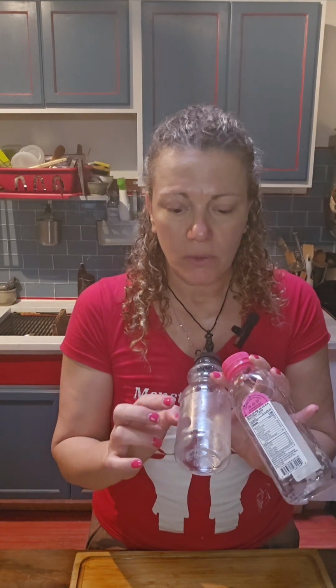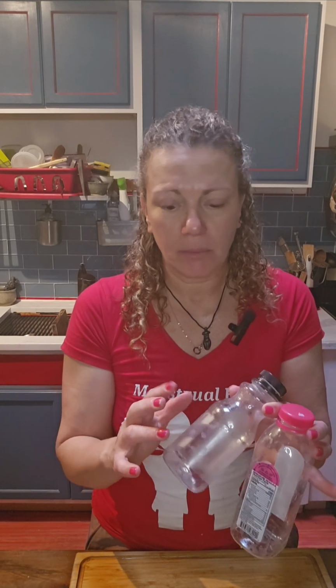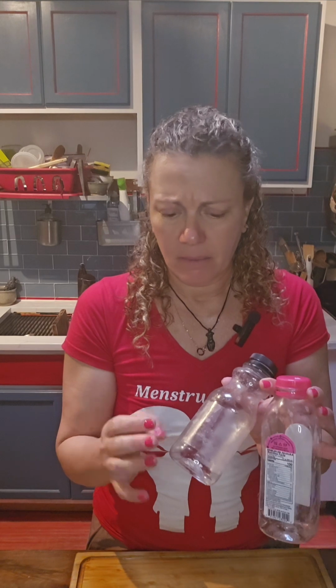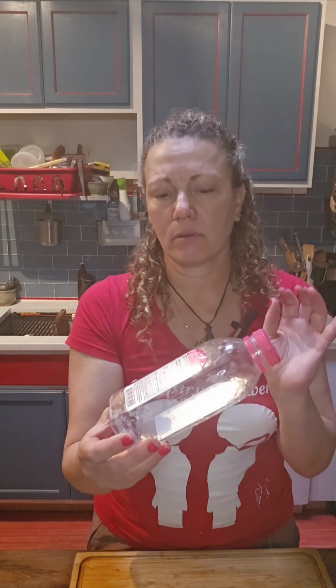So here I brought this to show you. This had a white label made from paper. So I managed with hot water to take off the label, but then the glue remains on the bottle, so it's not transparent. So you don't want that. You want to have a bottle like that.